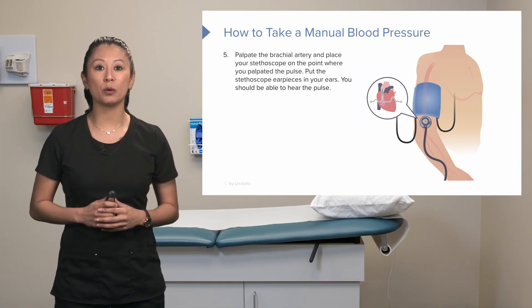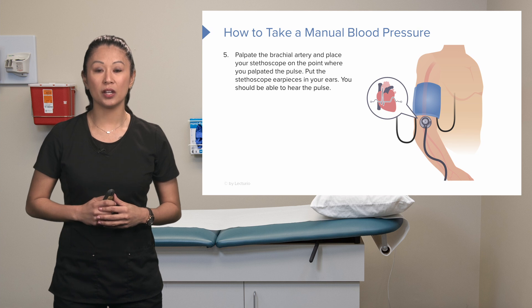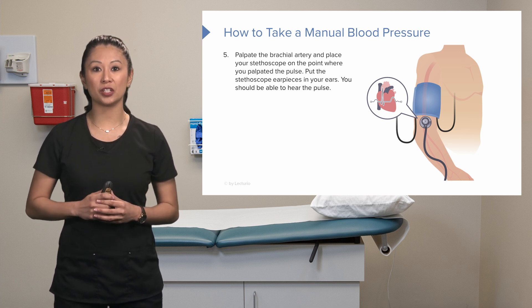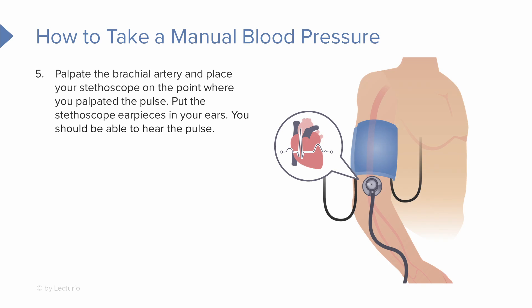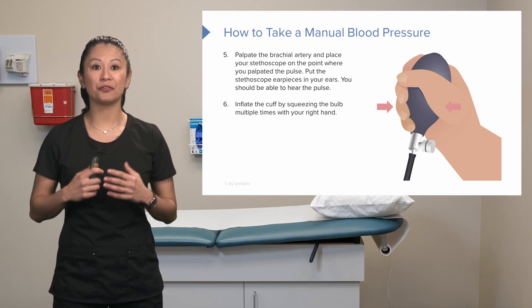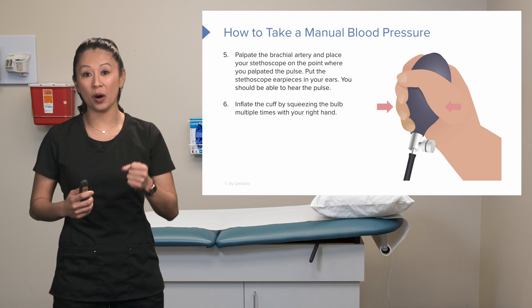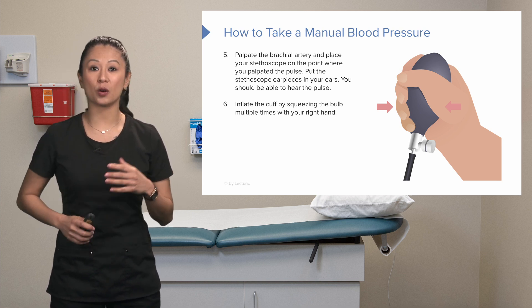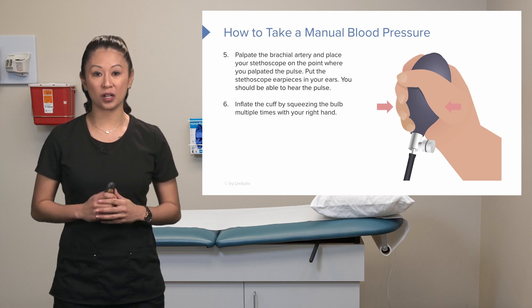Now we want to palpate what we call the brachial artery. It's important to take the blood pressure from this location. Place your stethoscope on the same spot where you palpated the brachial artery, put the earpieces in your ears, and you should hear the pulse in your stethoscope. This skill takes a little practice.